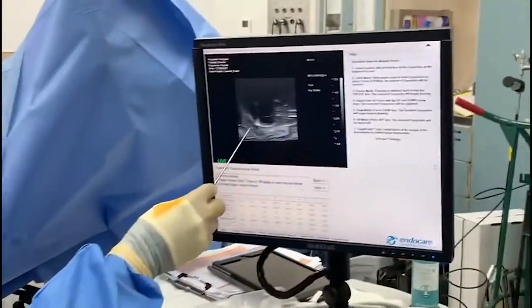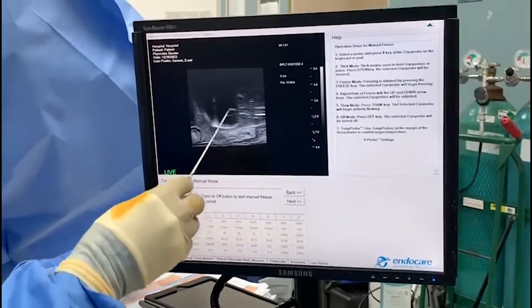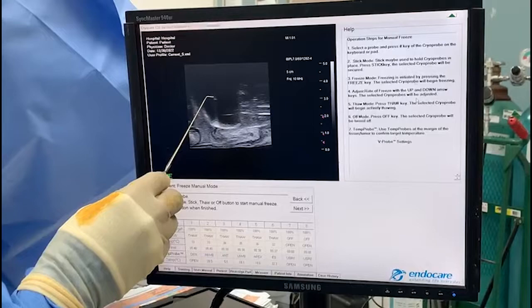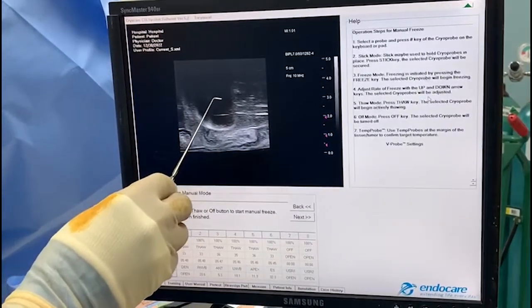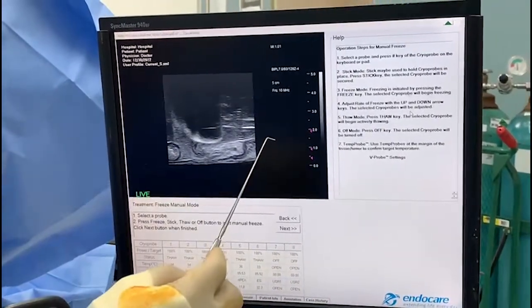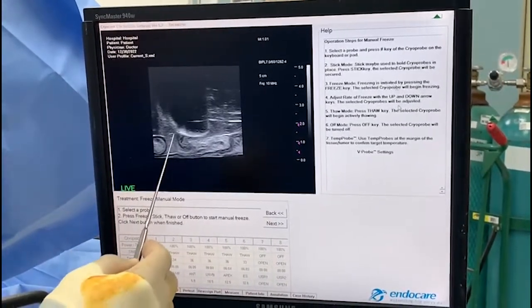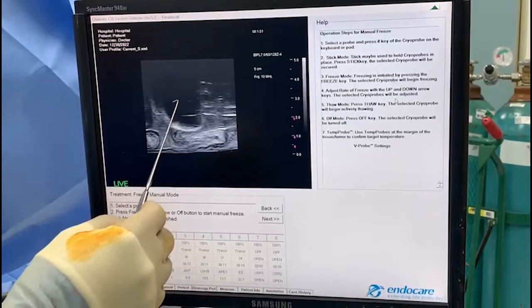You can see we're going through the thaw process now — remember it thaws from the inside out, not from the outside in. The ice ball is regressing. One critical point: the reason I turn off the first channel is that the anterior probe, if you keep freezing beyond eight minutes total, you'll start to get penile edema. So you should stick it early on. Another advantage is that I can start thawing the right side while keeping the left freezing, which would reduce procedure time — though I prefer keeping things even.